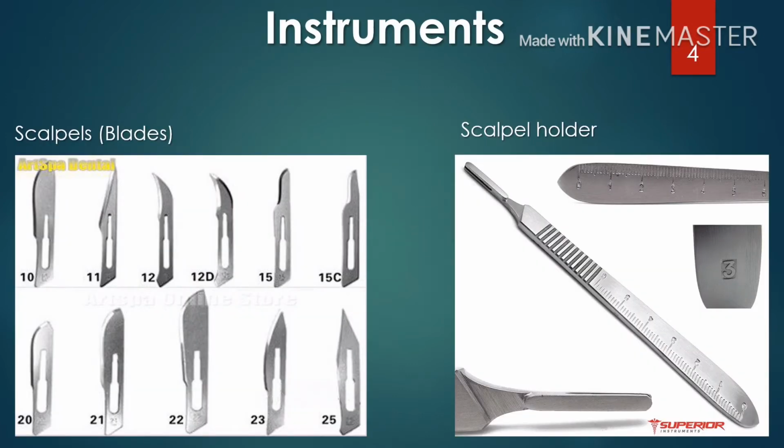We basically have two types of instruments that we use in combination to make an incision. The first one is the blades, which are called scalpels, and the second one is the scalpel holder. As you can see, there's a variation of blades which differ in size and shape, and we have only one scalpel holder that we use intraorally, which is number 3.